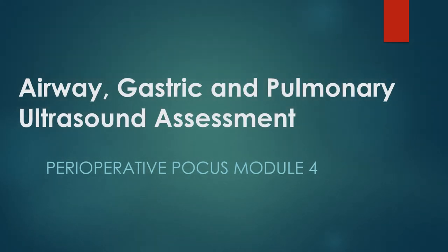This presentation is over airway, gastric, and pulmonary ultrasound assessment. We'll be talking about the expanding role of ultrasound in clinical decision-making, intervention, and management of the upper and lower airways. Ultrasound can be utilized to predict airway difficulty during induction of anesthesia, evaluate whether the stomach's empty or possesses gastric content that poses an aspiration risk, and localize the essential cricothyroid membrane prior to difficult airway management.